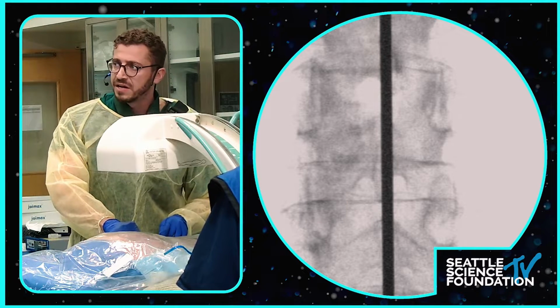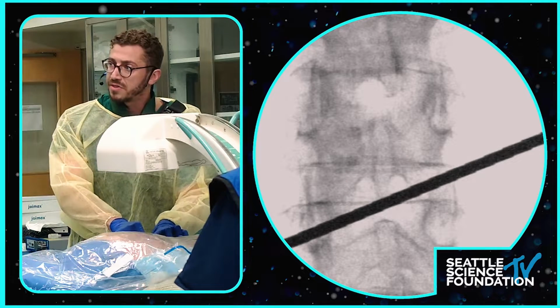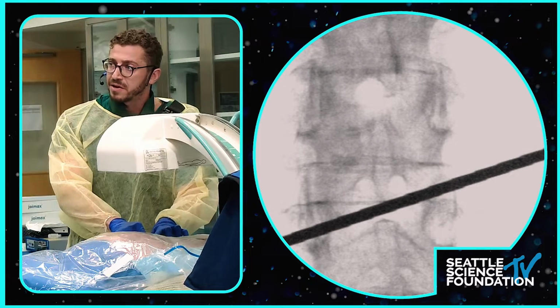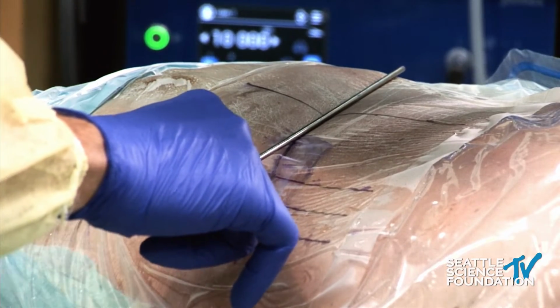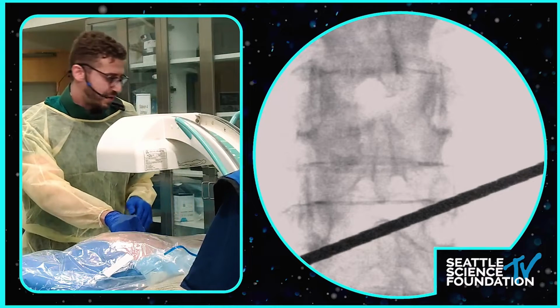But the traditional way, the way that works the whole time, is if you get an X-ray here, you want to cross the top of the pedicle on the same side of your approach, and then get the bottom of the pedicle on the other side. It's a standard way. If you had to pick one way of doing this, it's probably the best way, because you can always move your endoscope once you're in there.